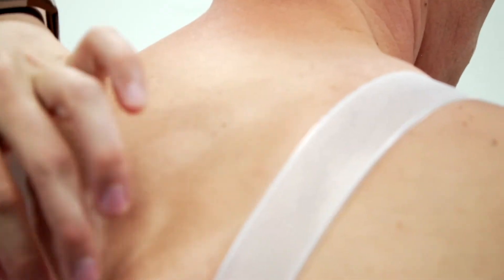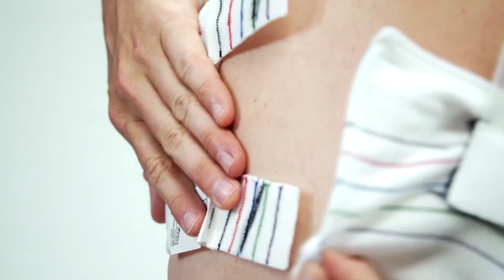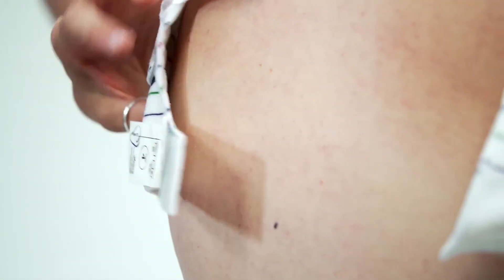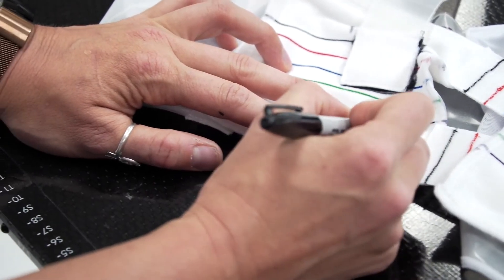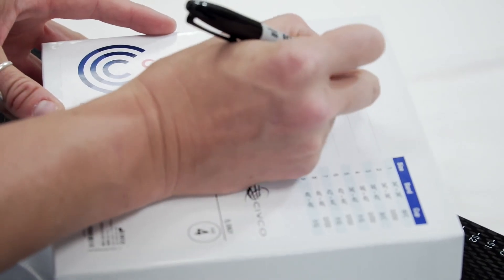Once simulation is complete, detach the two posterior horizontal Velcro straps, leaving the rest of the bra indexing in place. Write your patient's identification on the label and store in the original packaging.